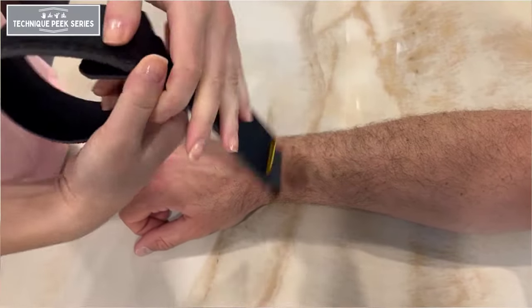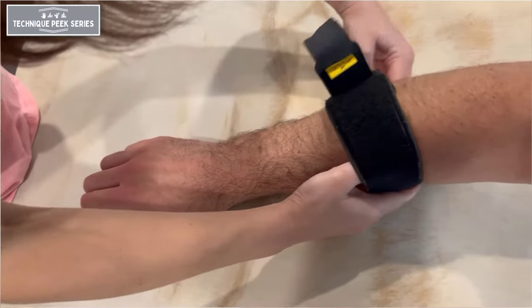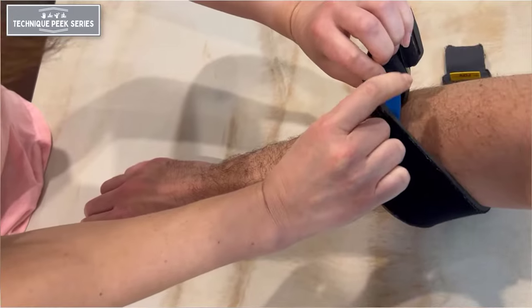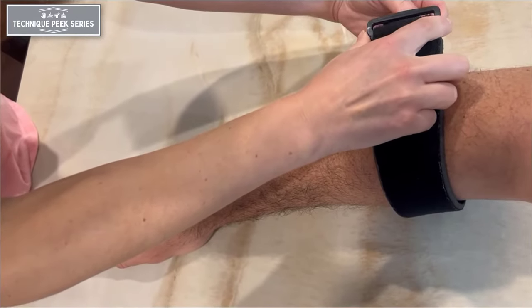Improper application of this brace can cause compression of the radial nerve at the radial tunnel. You'll first want to slide the band around the forearm, locating the extensor wad and placing the counterforce bubble over that area of the forearm.